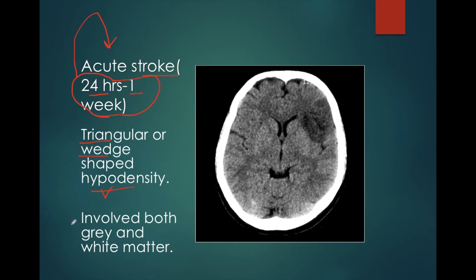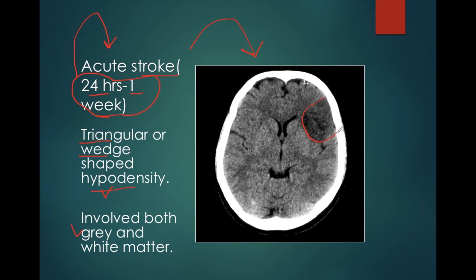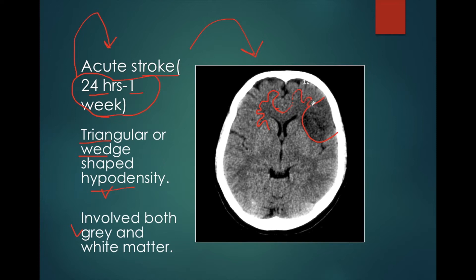The next criterion is that it should involve both gray and white matter. For example, in this case we can see that there is hypodensity noted in the left frontal and temporal lobe. This hypodensity is wedge-shaped and is also involving both gray and white matter. This is the white matter of the right cerebral hemisphere. Similarly, in the left cerebral hemisphere, this is the white matter and the part outside is the gray matter. So this hypodensity has involved both gray and white matter, and this is a case of acute stroke.